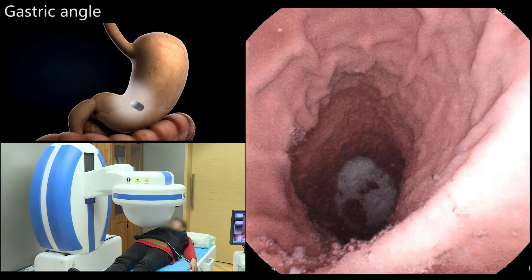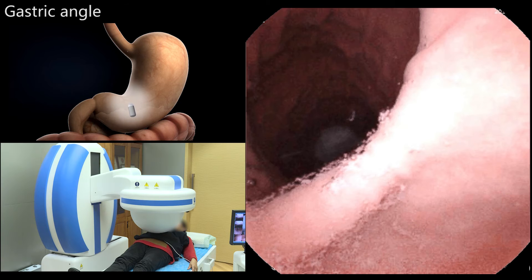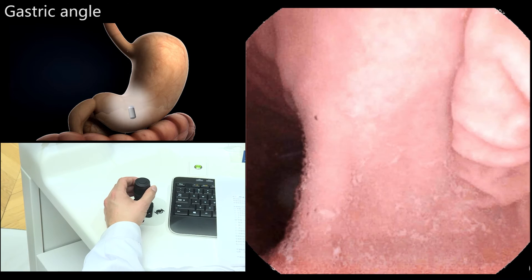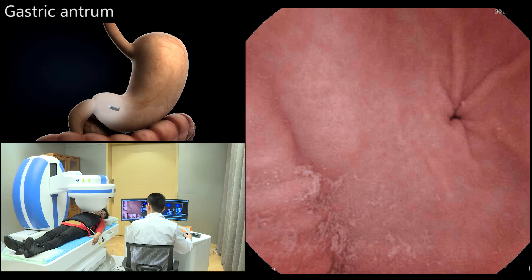With the patient in the supine position, the magnetic ball was moved to the left hypochondrium and then lowered to clearly observe the gastric angle. The capsule was then moved into the antral region.